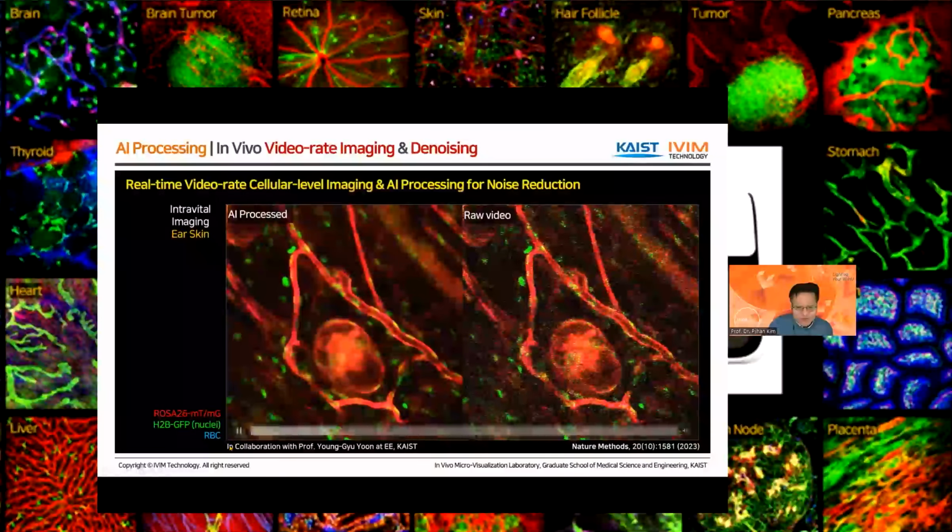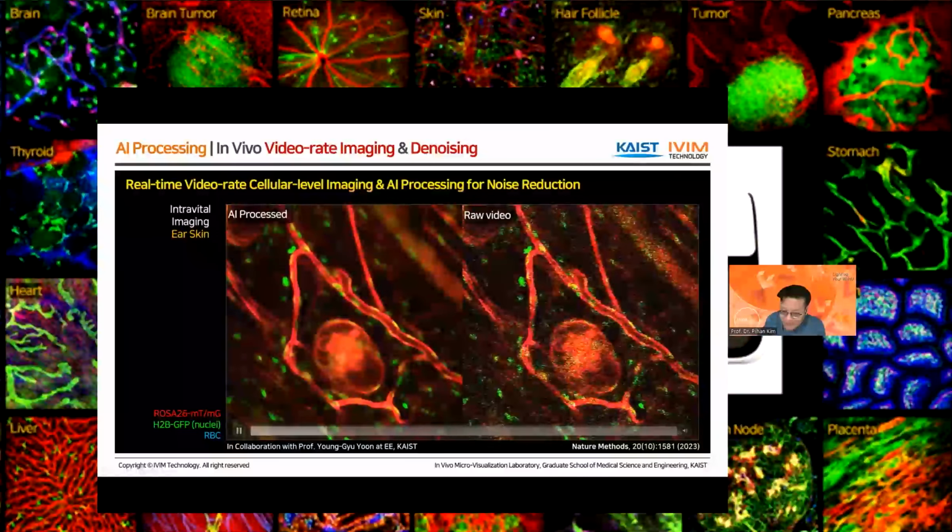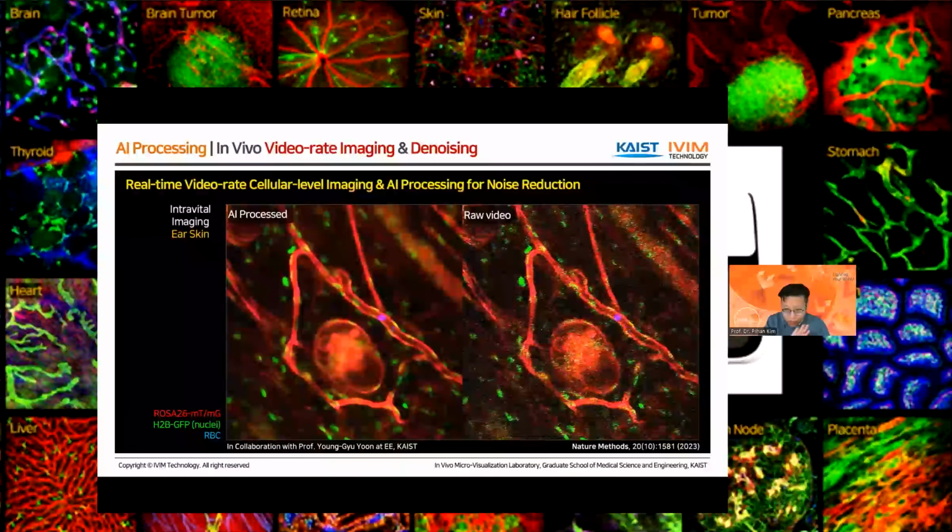Okay, let me move on. Also, very recently, actually last year, in 2023, in collaboration with another professor at KAIST, Professor Young Yoon, we developed an AI method to remove the noise from the real-time video, as you can see in this example.